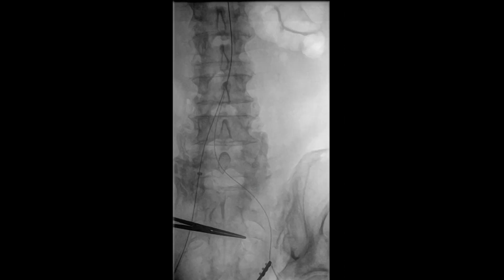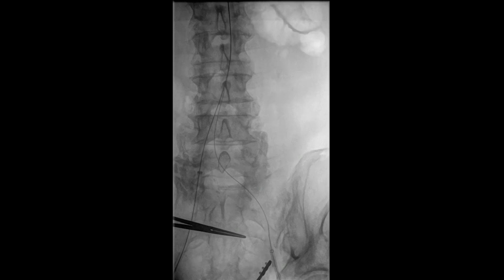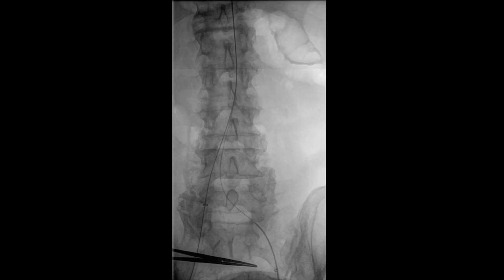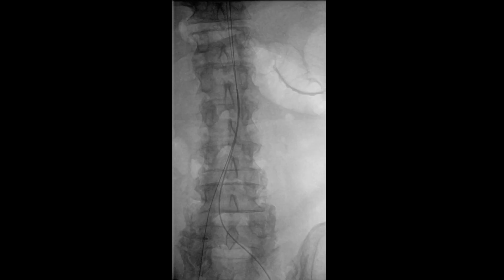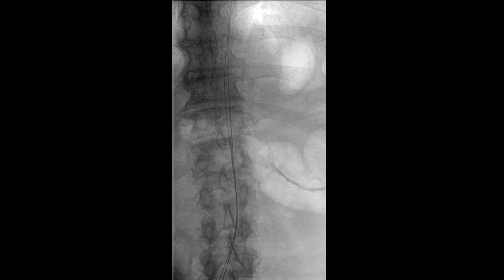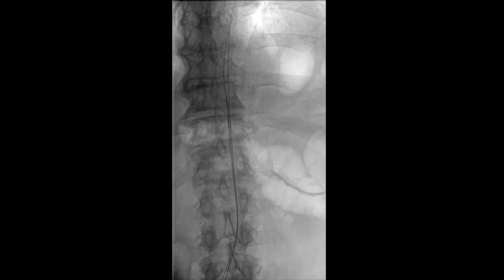A mini-stick needle and wire were then used to access the left common femoral artery, then upsized to a Benson wire and a 6-French sheath. This was followed by exchange for an Amplatz super-stiff wire and placement of a 16-French sheath through the left common femoral access site.